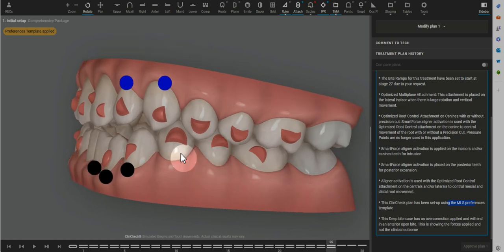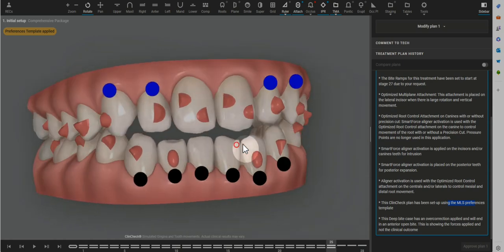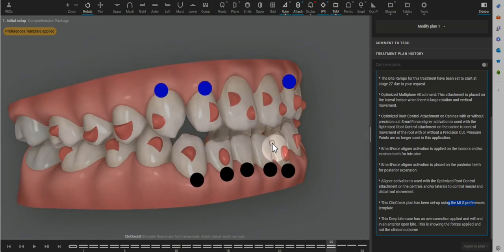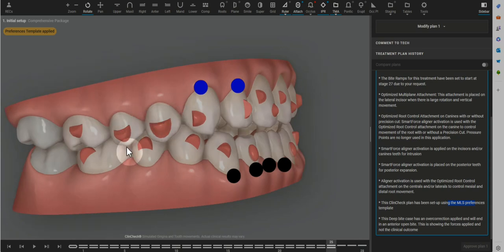In order to achieve the intrusion, having retention attachments throughout the premolars is really key. So that's great for the patient's left side. We're so close to the patient's right side.